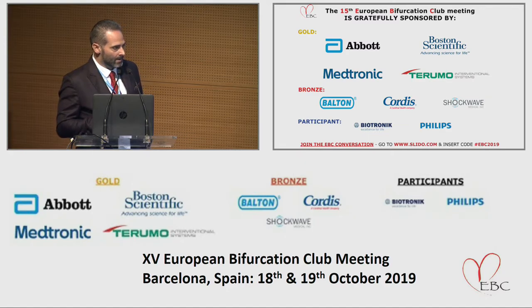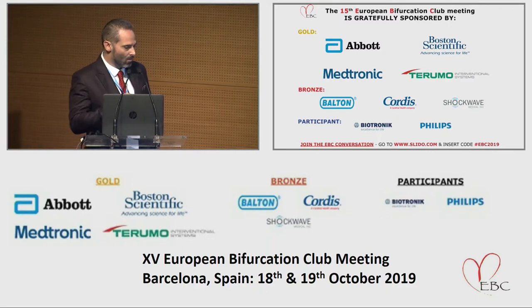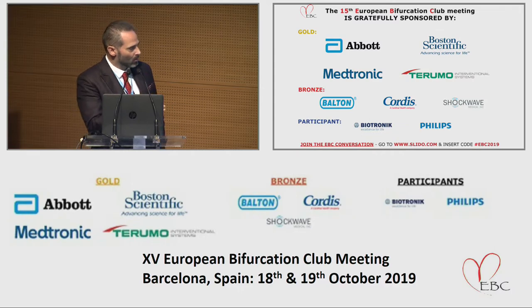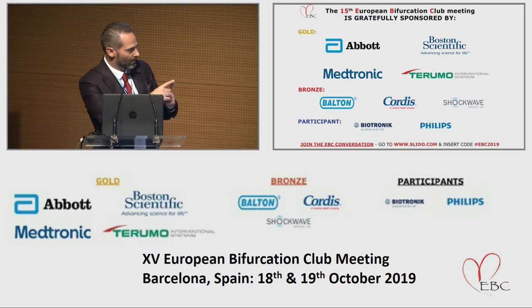The good thing is that, depending on the angles, you don't necessarily crush 1 millimeter of protrusion inside the left main, because the portion of the carina is covered by the side branch stent, but the contralateral portion, the opposite wall of the carina, the roof of the ostium, is covered by the left main stent when you do the POT. So you should not necessarily be crushing 2 millimeters, 1 millimeter inside the left main. Just the very small portion, the ring of the side branch stent, and then the rest of the opposite wall of the carina is covered by the main stent.